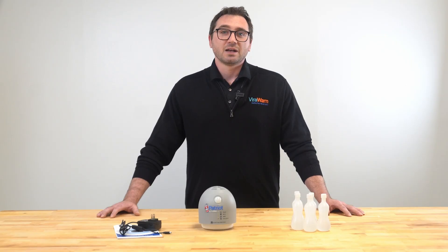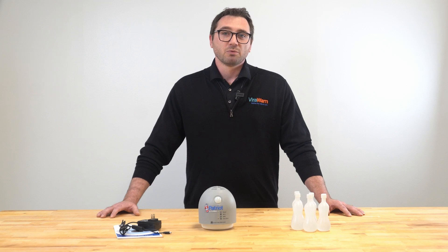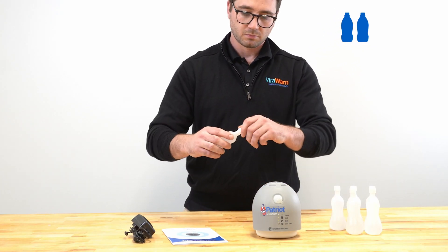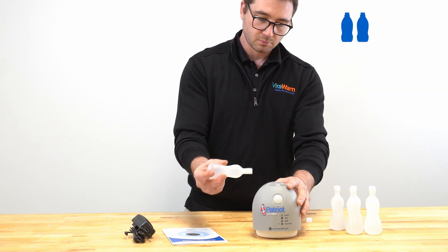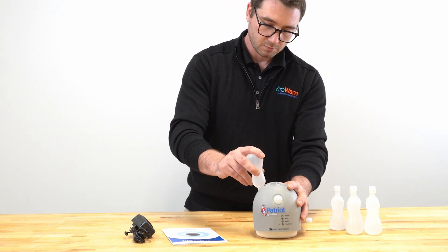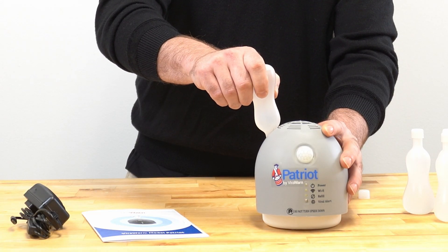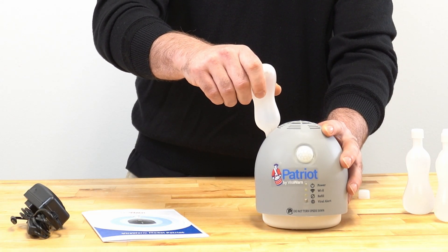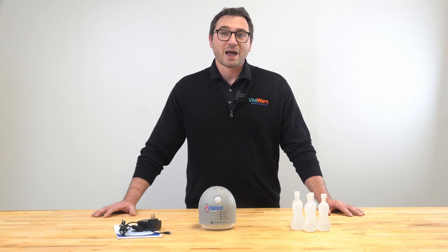Next, I'll show you how to add liquid media. Patriot by ViralWarn comes with 6 liquid media refill bottles. You will need to put 2 of those bottles into the device to fill it to capacity. The liquid media is a specialized engineered conductive media required for Patriot by ViralWarn's remarkable coronavirus detection ability. It is safe to use and completely non-toxic, so please do not worry if you accidentally spill any while filling the device.